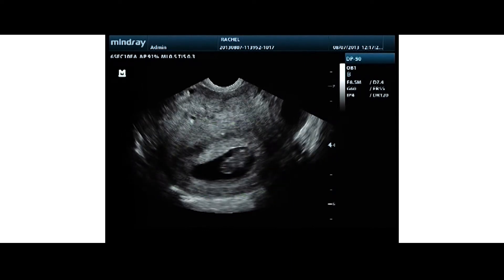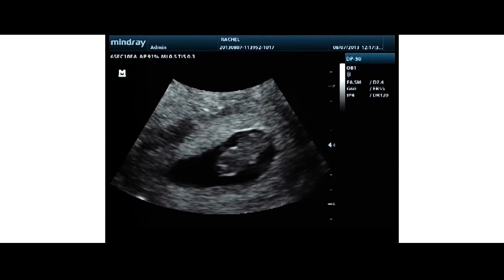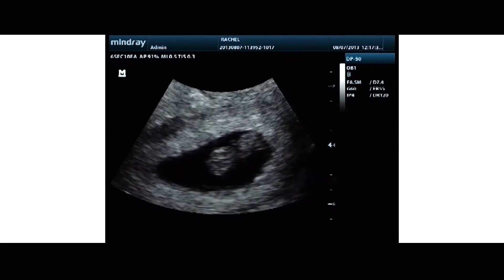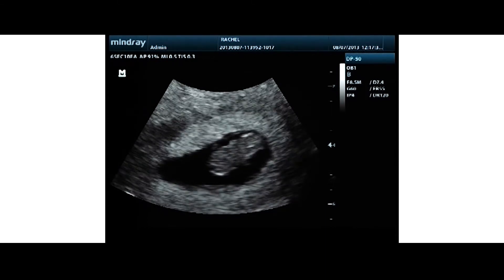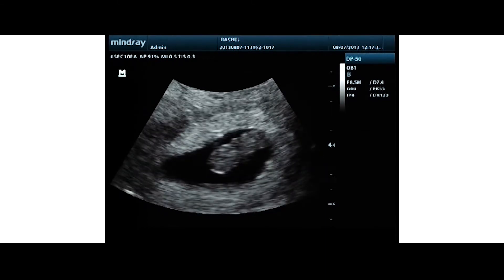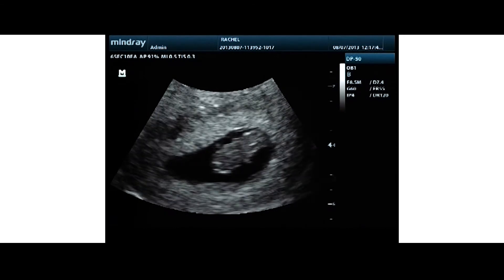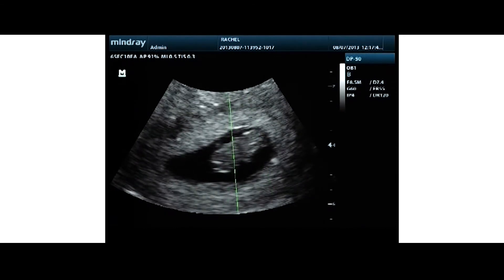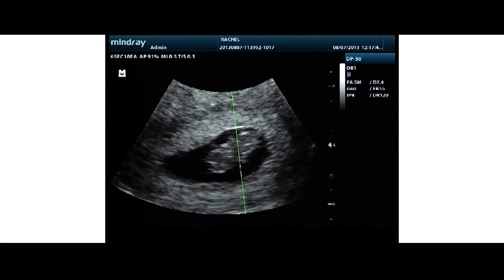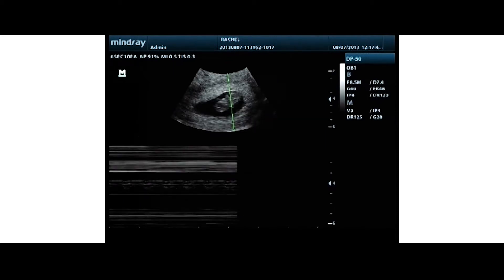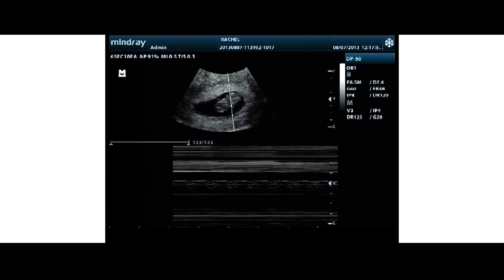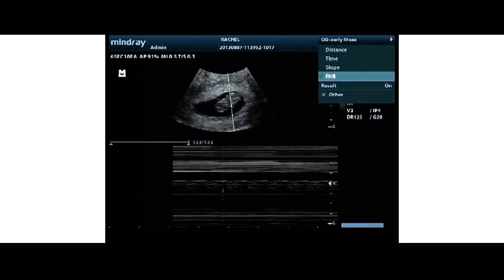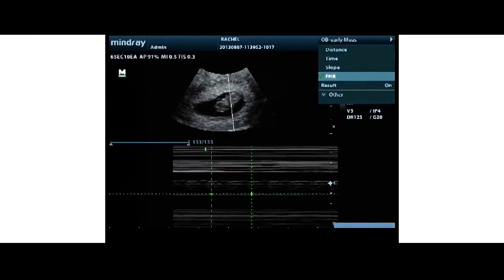I'm going to zoom in a little more using my zoom again — you don't lose resolution, you're not blowing out pixels, you don't expand the pixels, you just take the image and enlarge it. You get good cardiac activity here, so let's go ahead and put this little heartbeat through and hit update. You get a nice M-mode tracing there — very nice. We'll go ahead and measure that, skip a beat, and save.